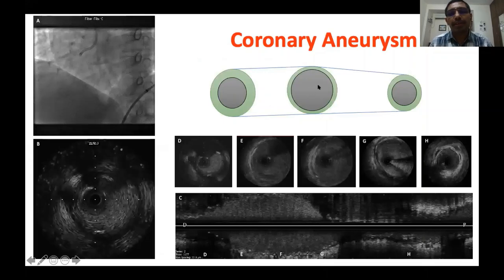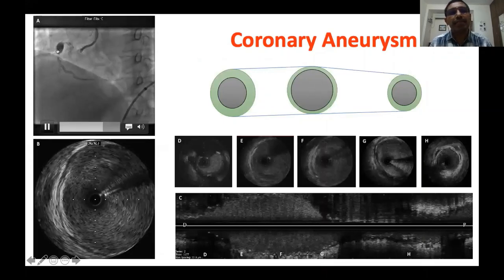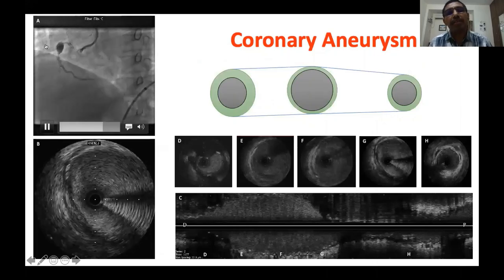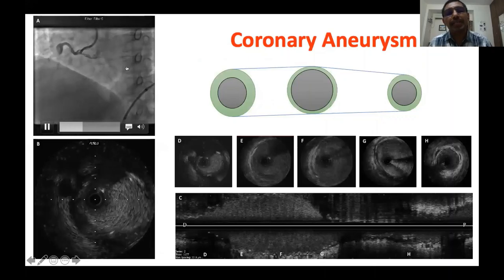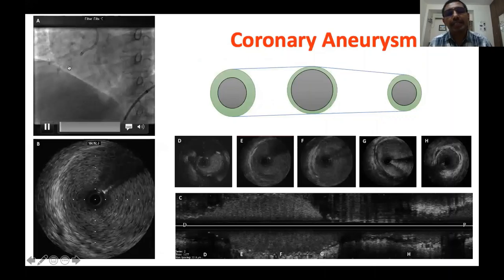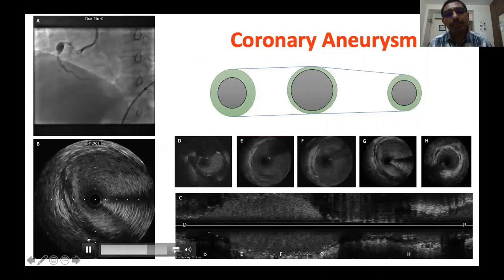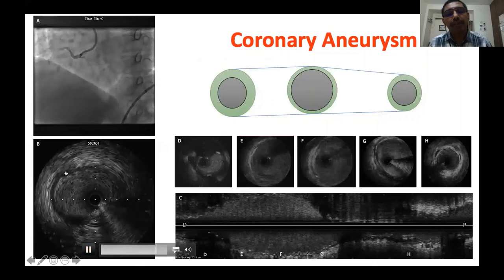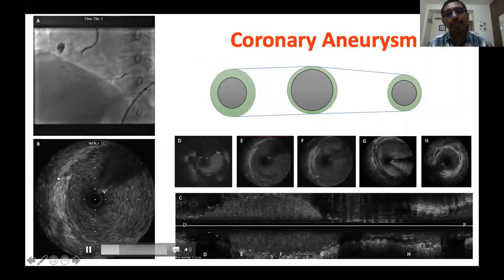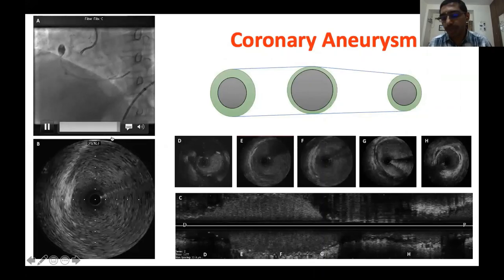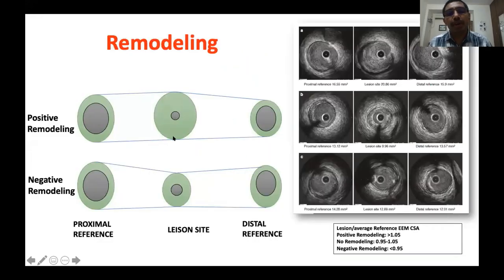Coronary aneurysm is defined with IVUS the same way as with coronary angiography — a segment that is more than 1.5 times the diameter of the reference segment. This is the typical appearance of aneurysm. IVUS helps in differentiating true from false aneurysms: when you see all three layers intact it is a true aneurysm; when there is a breach in the vessel wall continuity that is a false or pseudoaneurysm, easily identified with IVUS.